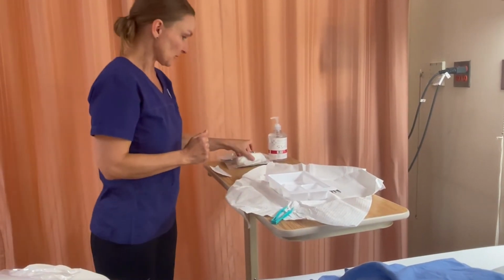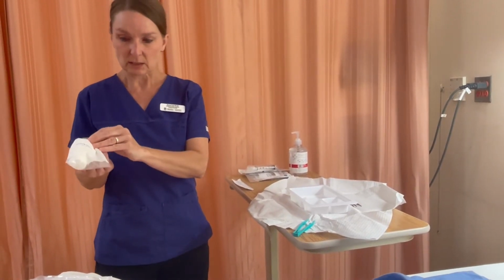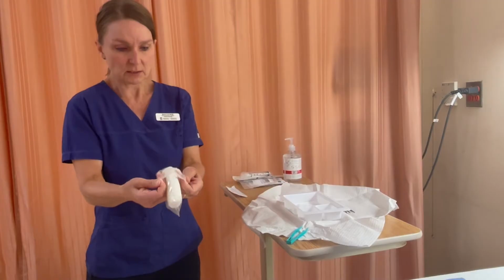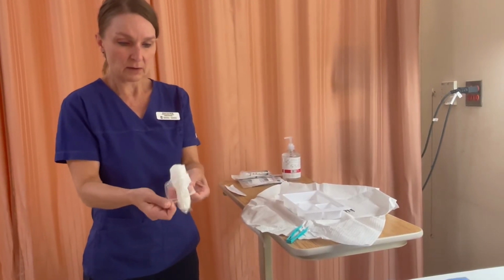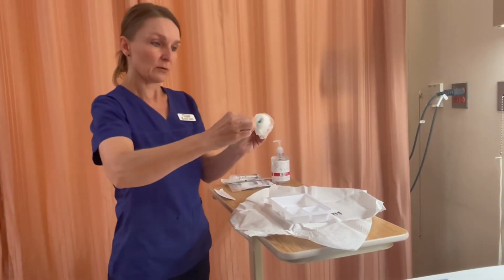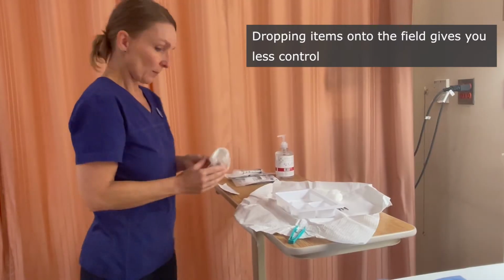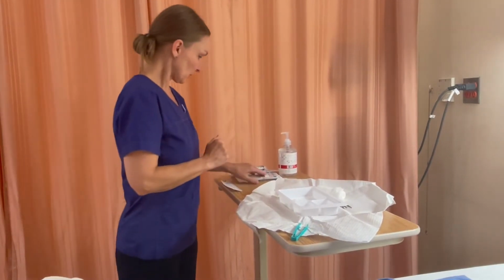Now I would like to add several supplies. I know I'm going to need new gauze. Actually, this is Curlix, not new gauze. And I'm going to even emulate what it looks like to pull it out with sterile technique. Folding back, winging back, putting this in my garbage.